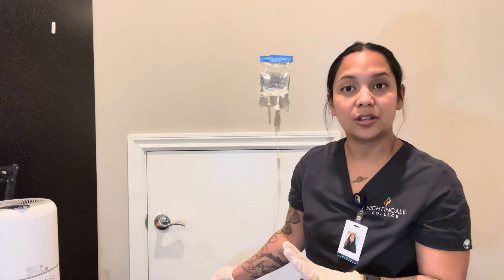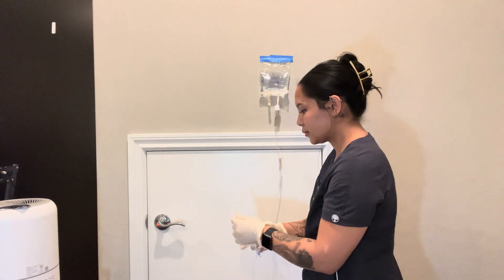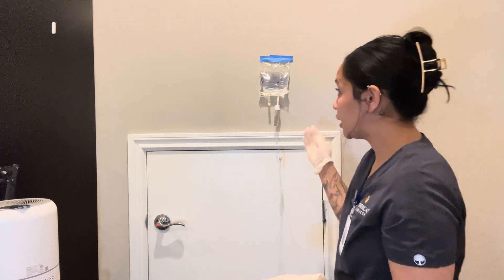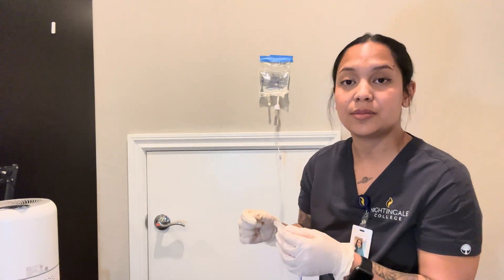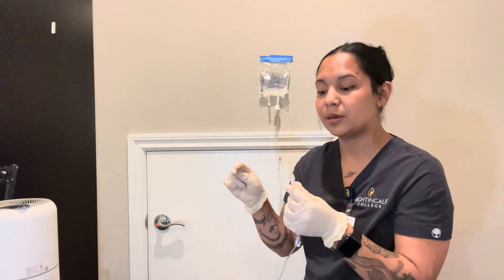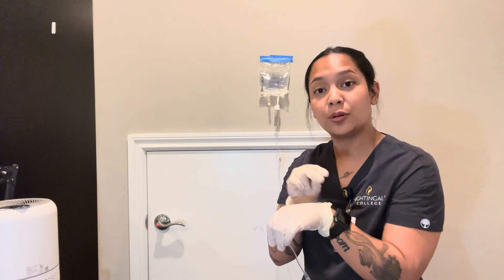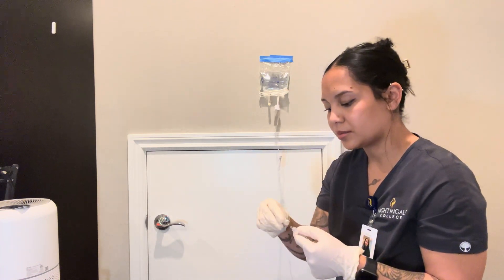I've counted the 38 drops for a minute. And from there, I can give this to my patient. I would just make sure I use an alcohol swab to wipe both this and their port, and then connect the tubing to the patient.